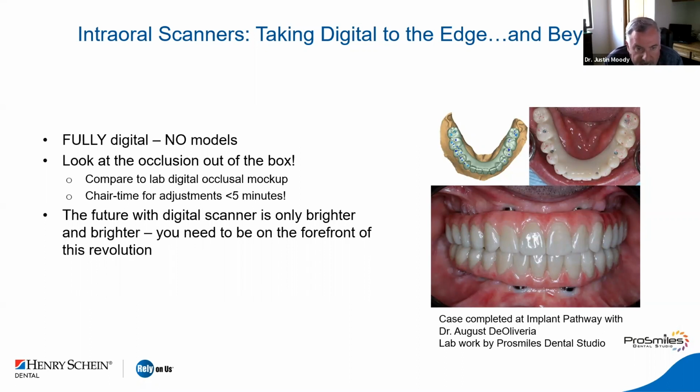And today we have digital x-rays. And I think very few of you have even been exposed to film-based radiology. And if you did, or if you still do, it's got to be on your horizon of changing over to that digital world. So you got to jump off, at some point.